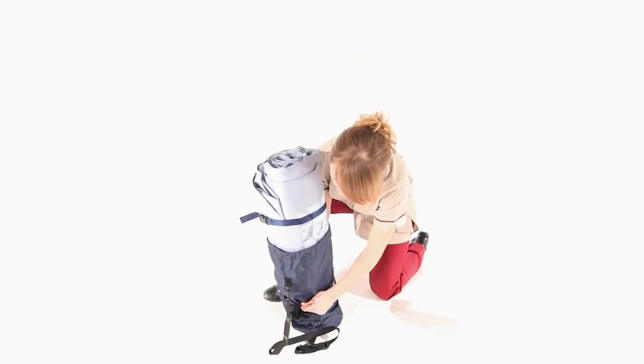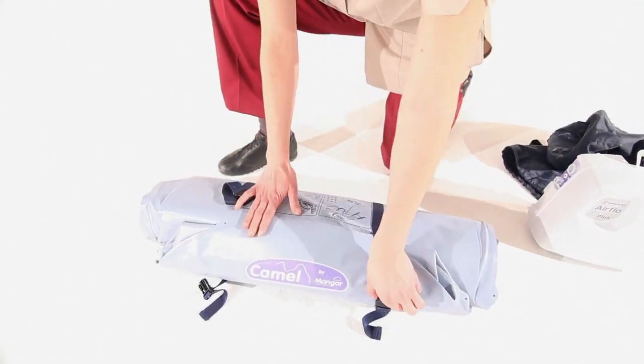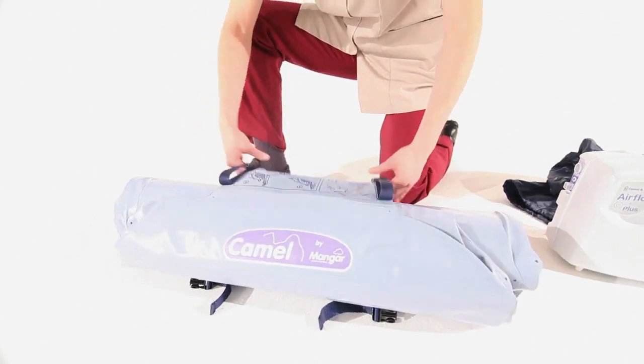Before using the Camel, it's important to plan the entire move. For example, consider how the person will transfer off the Camel and whether a chair, frame, or wheelchair will be required.